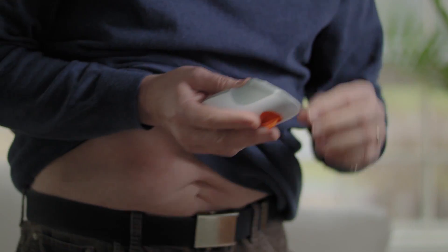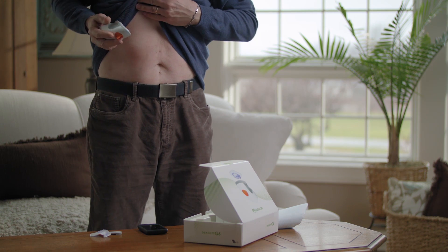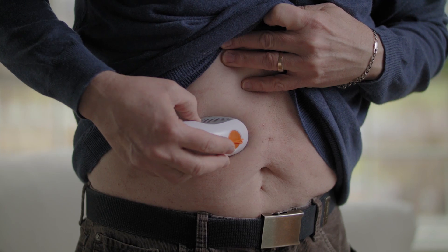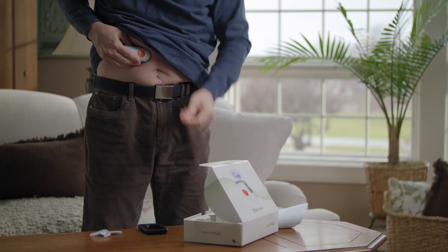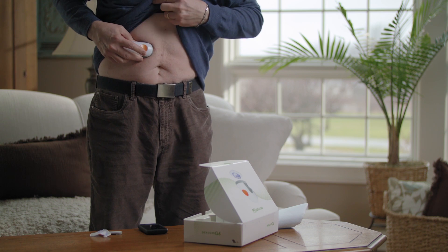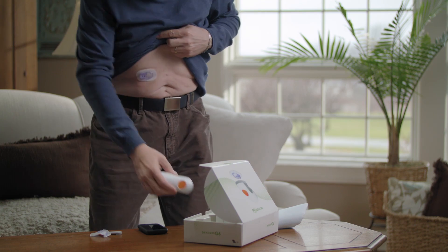Clean your skin with rubbing alcohol and let it dry. Remove both labels. Do not touch the adhesive. Place the applicator on your skin. Fold and break off the safety guard. Press the button to insert the sensor. Remove the applicator. You've successfully inserted your sensor.